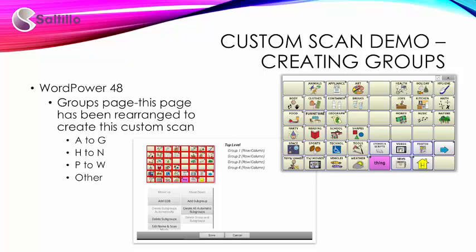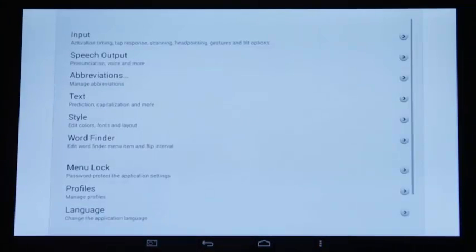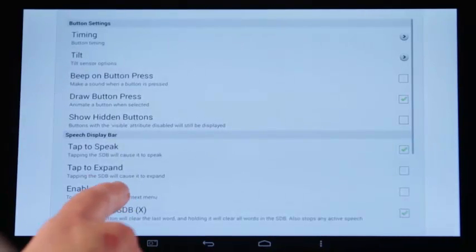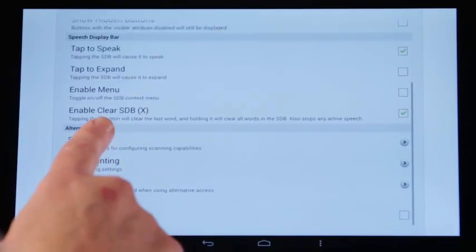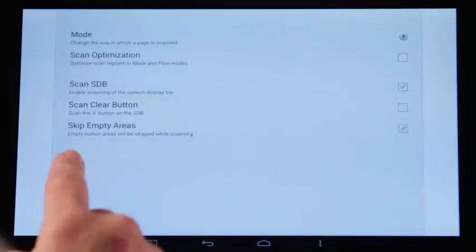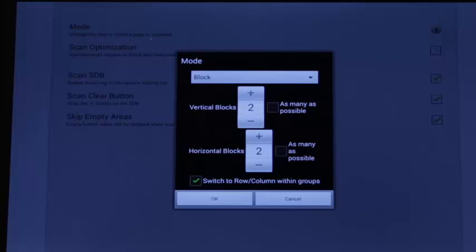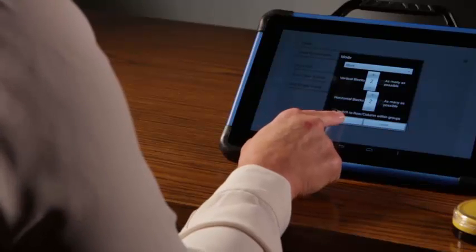Let's confirm the settings are set for this example, then I will set up the custom scan pattern using the scan editor. Tap Menu, Settings, Input, Scanning. Ensure that Enable Scanning is checked. Tap Patterns, Mode, and Block. Vertical and horizontal blocks are set to two by two, creating two vertical blocks and two horizontal blocks. It is defaulted to switch to row column within the block. Tap OK, tap Go Back.